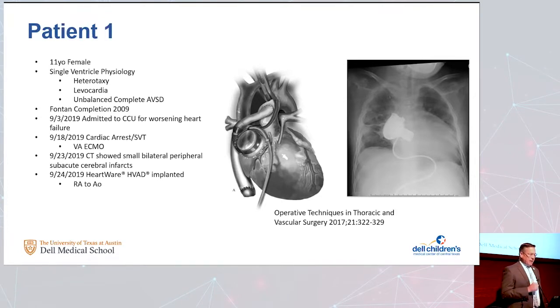Another challenge, we actually implanted this from the right atrium to the aorta. We did this for a few different reasons. One, I just said we had 120 minutes of CPR. So the chest was really beat up.